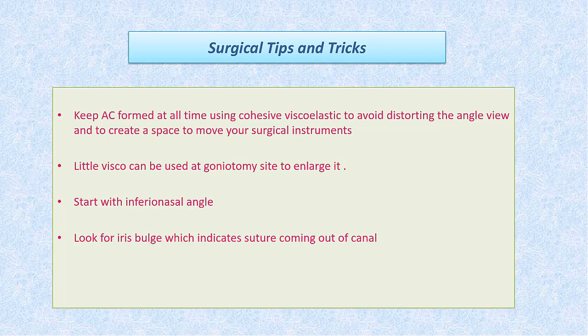Look for iris bulge, which indicates the suture coming out of the canal. It is normal to have some resistance at 180 degrees.